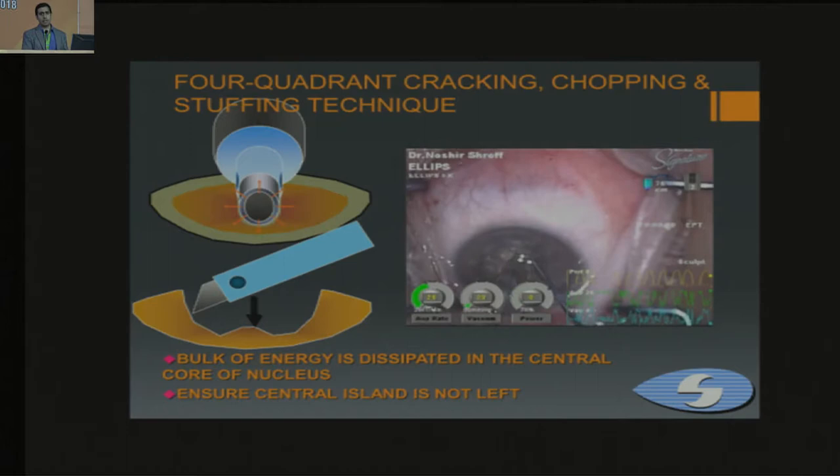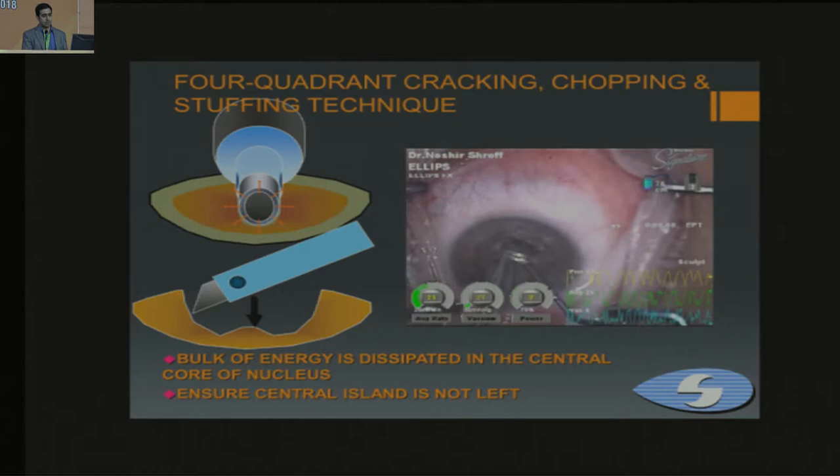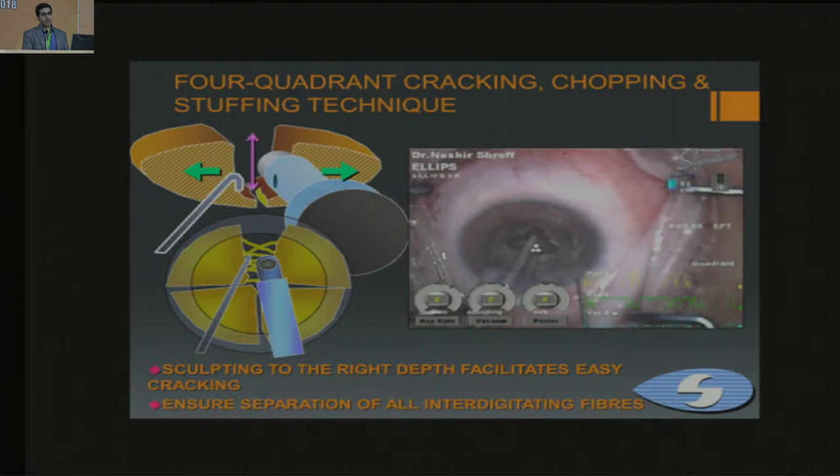In harder cataracts, you assess trench depth by looking at the orientation of the lens fibers. There was a paper published by Dr. Korean's group from Narayan Netrale showing what to look for in lens fiber orientation when performing trenches. It is essential to ensure that there is no central island left over when trenching, and that it is deep enough.